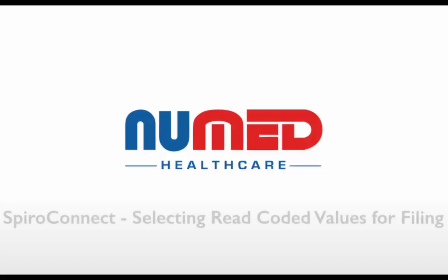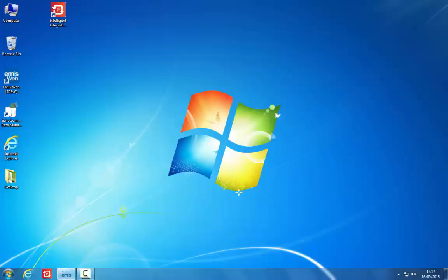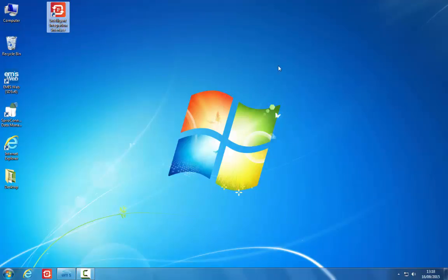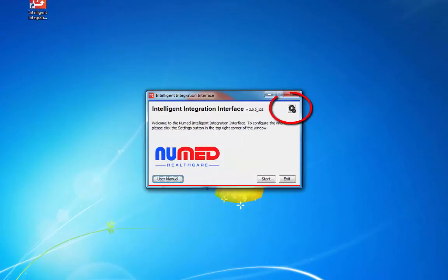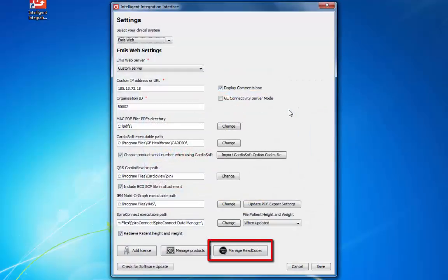Selecting the read-coded values for filing. The i3 software offers a wide range of data values for filing to the clinical system. You will not necessarily want to file all the values available. If there are read codes that you know you will never want to file, you can disable them and prevent them from appearing on the filing screen. Start the i3 software, click on the Settings icon, and then the Manage Read Codes button.